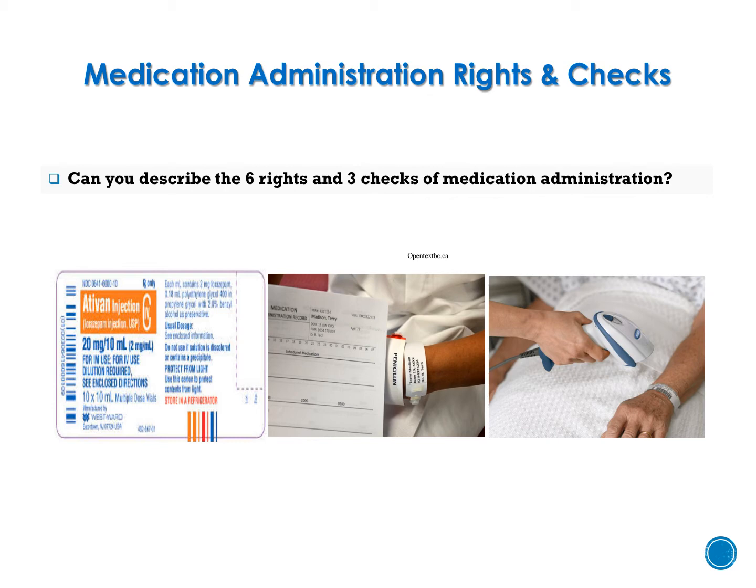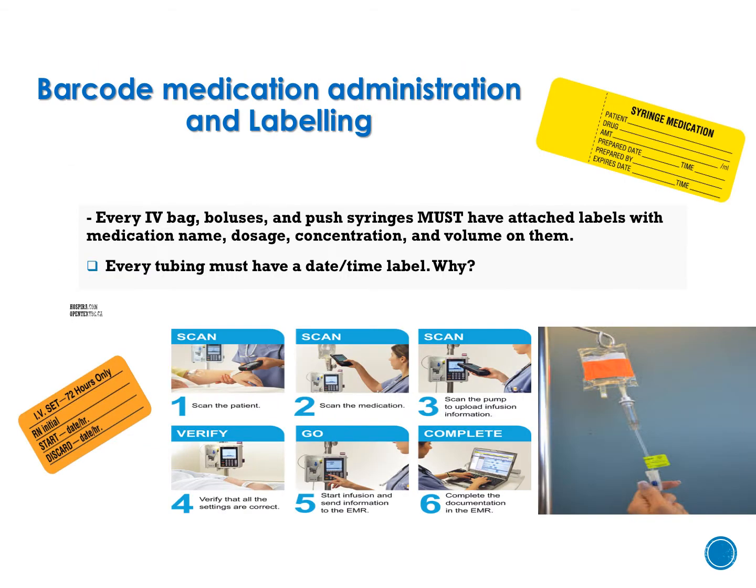This is an illustration of what has a drug label first. So medication and dosage there. They're showing the patient's armband, so we're checking name, date of birth, asking about allergies, and then using barcode scanning technology as another safety check. We talked about barcode scanning, also making sure that your medication, whether it be the syringe or the IV fluids, everything needs to be labeled appropriately.